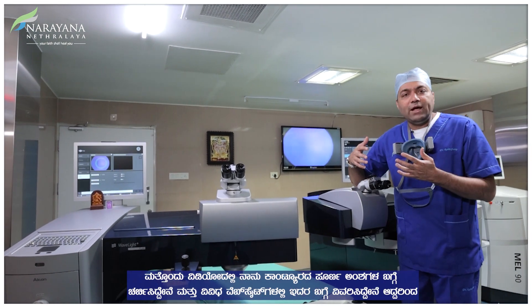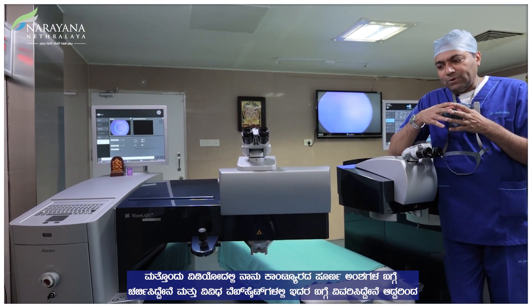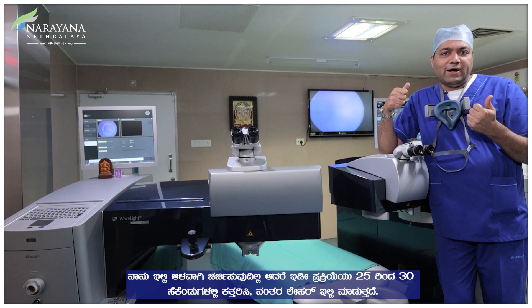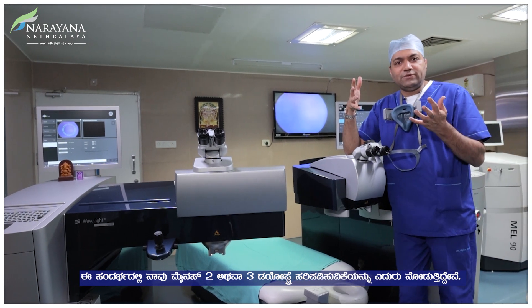I have discussed the whole aspects of Contura in a different video. So I'm not going to go into depth here, but the entire process takes around 25-30 seconds for doing the cut and doing the laser. In this case we are looking at around minus 2 or 3 diopters correction.